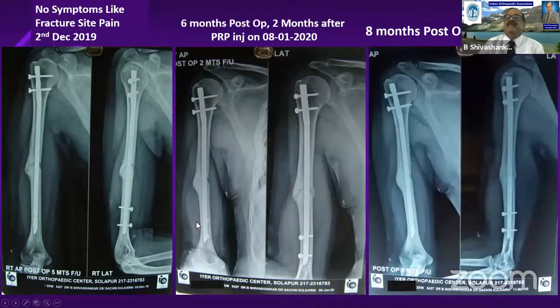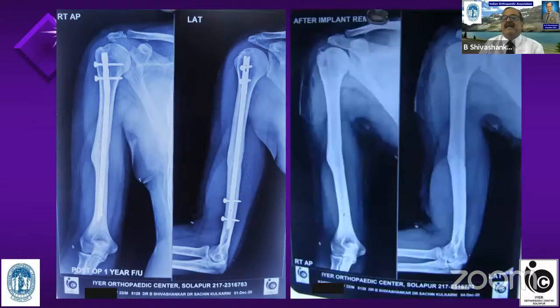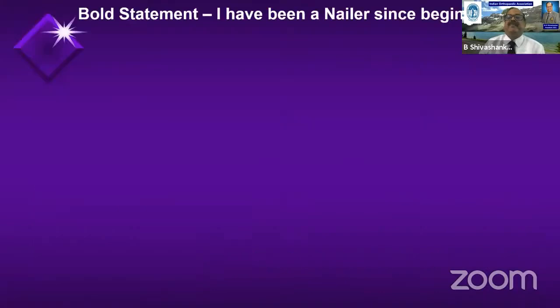This is 8 months after the initial surgery. This is 1 year after the initial surgery. You can see beautifully the fracture has consolidated. And as I said earlier, I almost always remove my implants. I don't want them to be left in the body, so they don't have any work in the body. So I have removed these implants. This is the function 1 month after the removal of the implant.